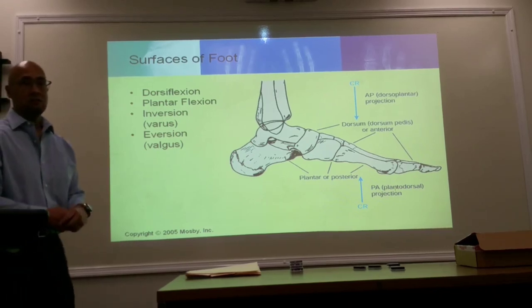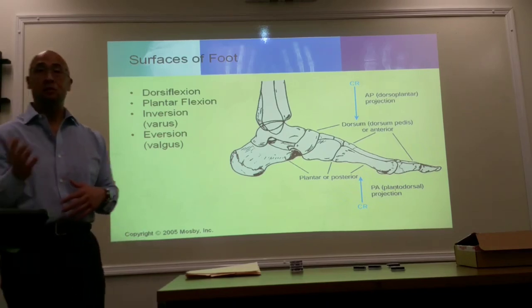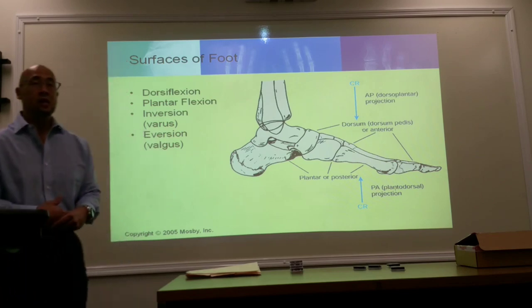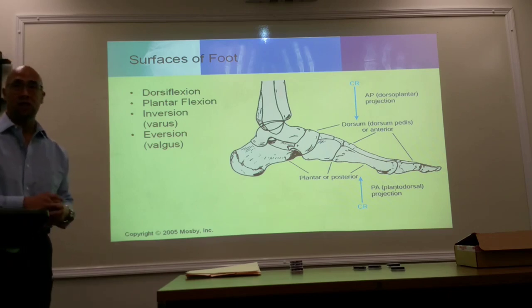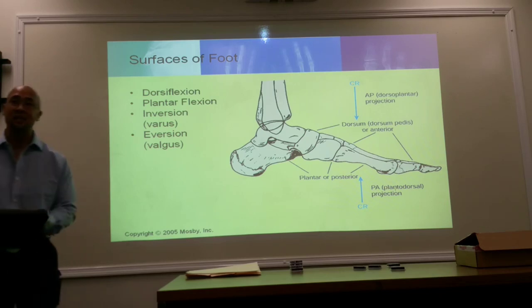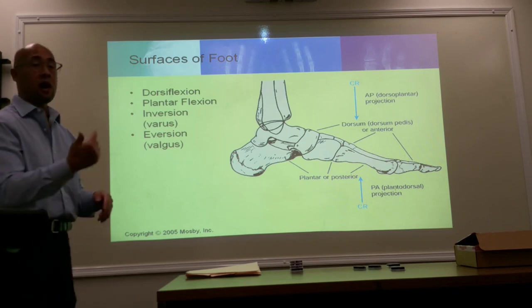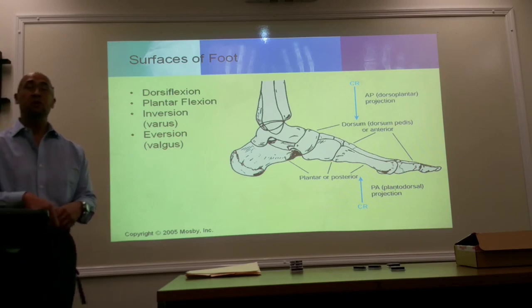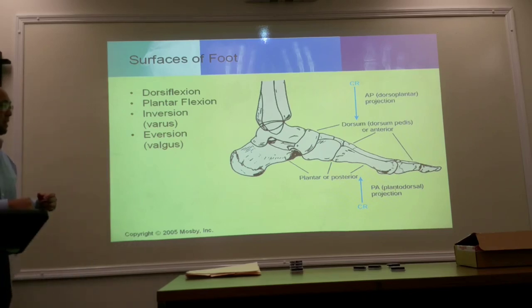Now, in terms of projection, this is where it gets a little bit confusing, because sometimes we'll say AP, sometimes we'll say PA, which becomes a little bit confusing again. So if we're doing an AP projection, the correct term for an AP projection of the foot is dorsoplantar projection, entering the dorsal surface and exiting the plantar surface. Okay, dorsoplantar projection. Therefore, the opposite, if we were doing PA, going from the posterior to the anterior surface, is a plantodorsal projection. All right.